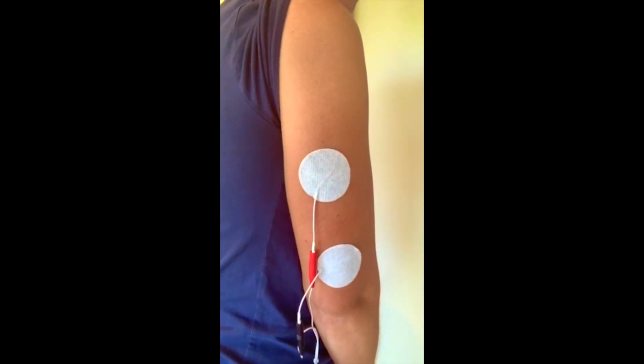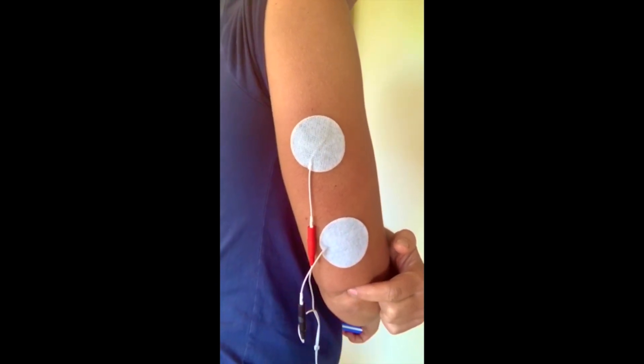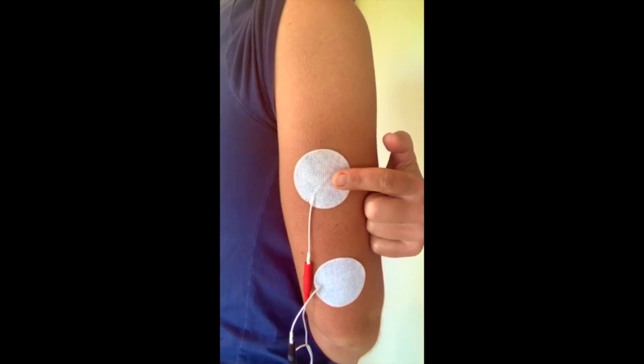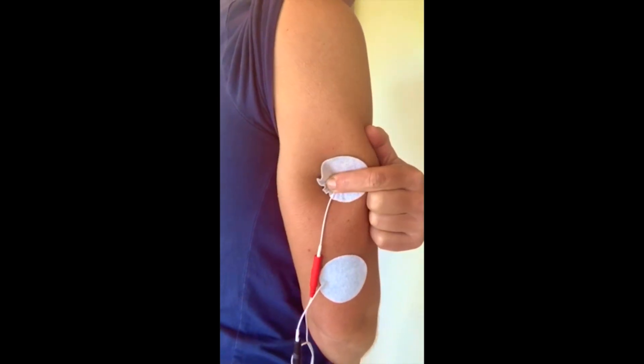Electrode placement for elbow extension. Got one electrode just above the olecranon, or bony bit at the elbow, and one electrode on the belly of the triceps — so mid upper arm.